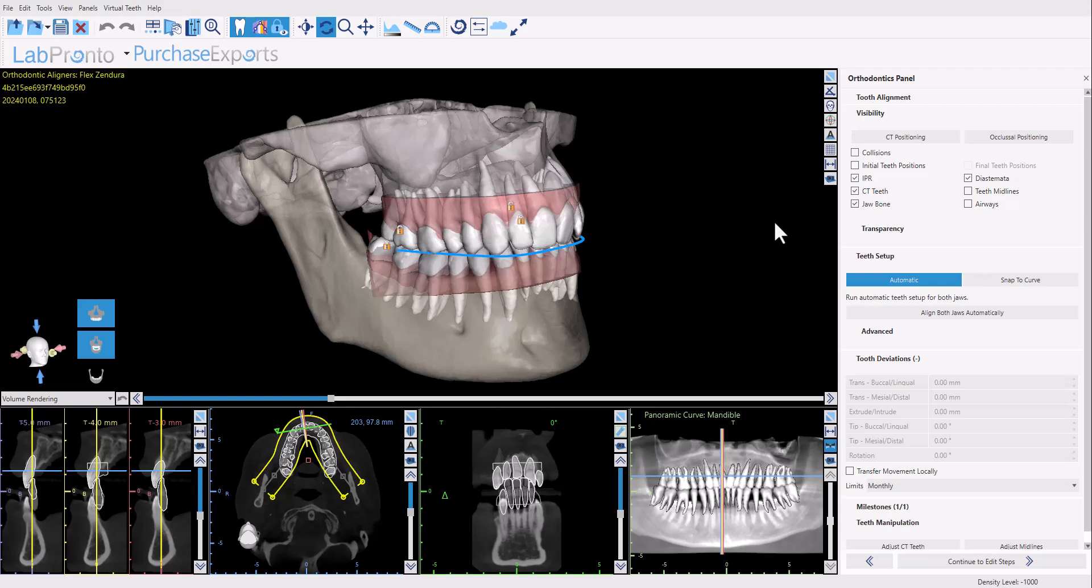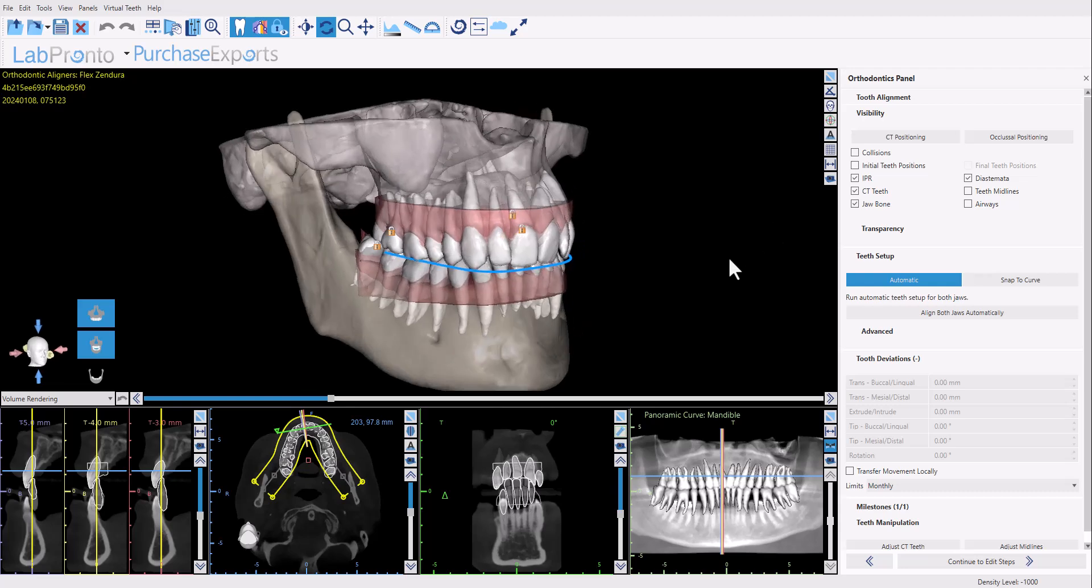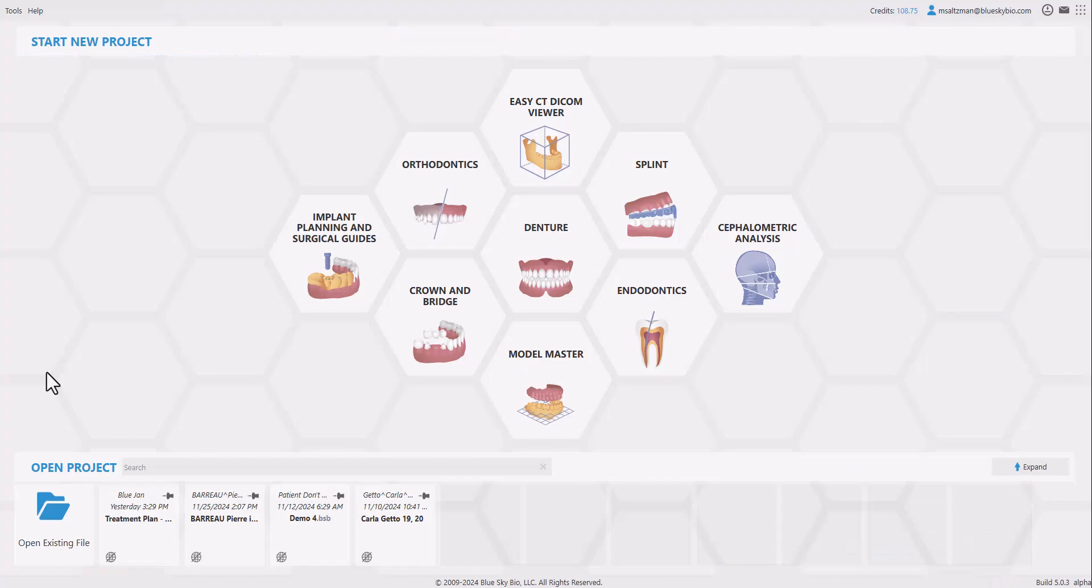However, when there are situations for mid-course refinement cases, I am going to demonstrate our new automatic replanning functionality in BlueSky Plan. The situation is that we have a new optical scan or a new intraoral scan with the new models for the patient since his teeth are not tracking correctly.